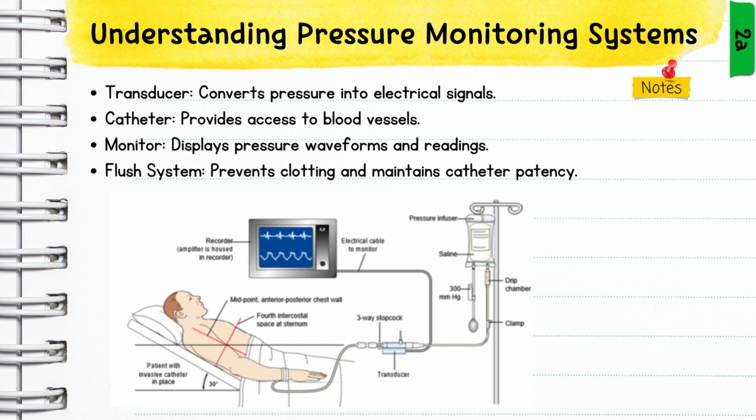Obviously, you know what a monitor is, okay? Oftentimes, the same cardiac monitor that's up on the wall that does the blood pressure and the heart rate and all that kind of stuff, if you have the right cords to plug into the electrical cable for the art line or the CVP or whatever, then they all plug in.